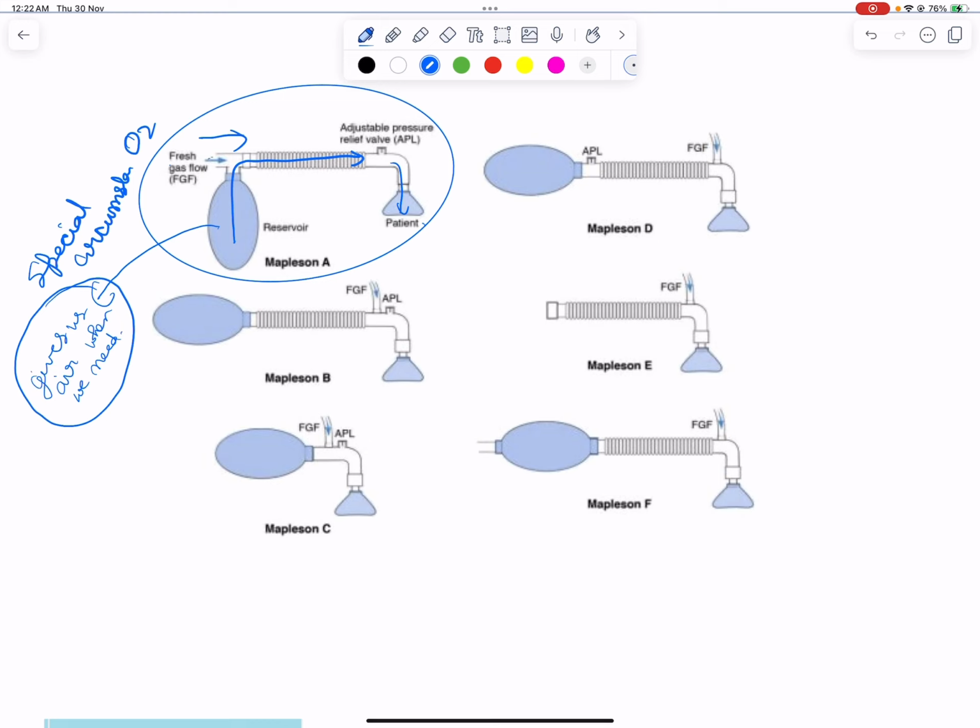And in the meantime, when again the supply is developed, then this oxygen from this pipe will go into this bag and directly also, and then this will again be reserved. So up till now you have understood what is the function of reservoir.